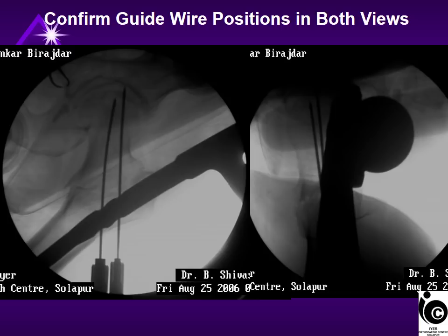Normally, the inferior guide wire tries to bend slightly upwards and the superior guide wire tries to bend inferiorly because of the trabecular pattern. So don't keep changing the guide wire at this stage, because that's the path of least resistance, and the guide wire, which is very thin, 1.8 or 2 millimeter, is going to bend and go in the same path. So we can tackle that at a later stage. As long as the guide wire is properly placed in the neck, you accept them.